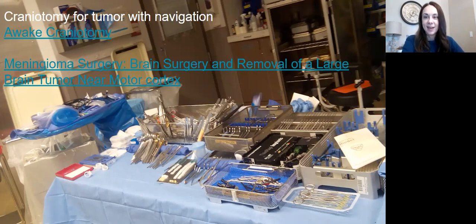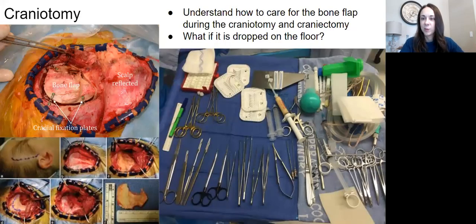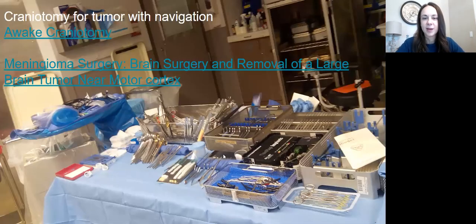And I loved that because it was so precise and we could do what was called a keyhole craniotomy. So it's very minimally invasive, about the smallest bone flap possible to give the quickest recovery possible for these patients. So anyways, this is my setup, but we're still same procedure. So we've gotten the bone flap off, we've gotten to this point, and now we can take the tumor out. So now they're going to bring the microscope over and we're going to do the tumor resection. This will all be done with these microscopic instruments.